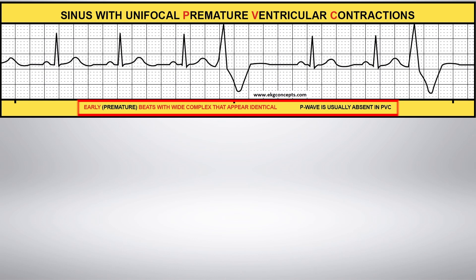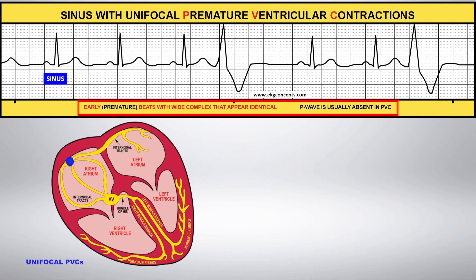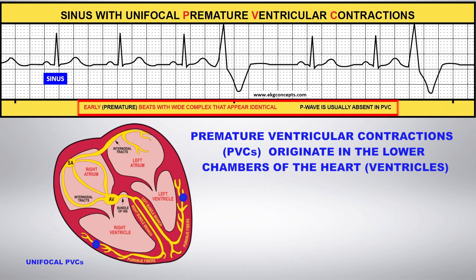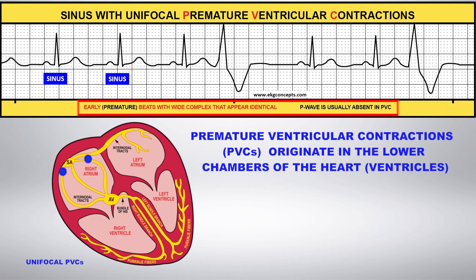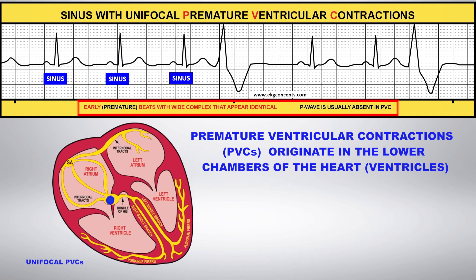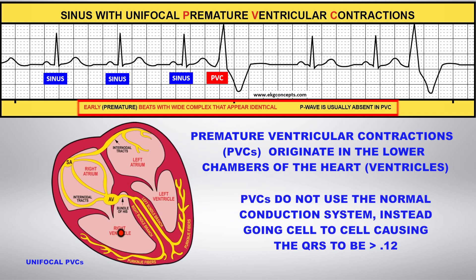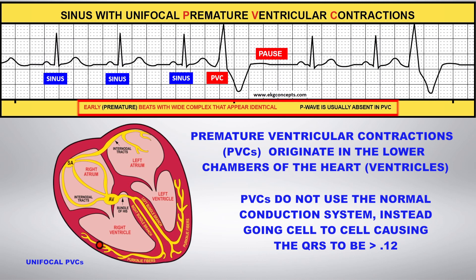Unifocal PVCs originate from one irritable ventricular focus in either the right or the left ventricle and appear identical. Usually a PVC is followed by a compensatory pause.